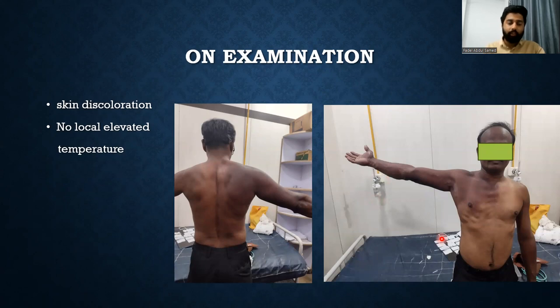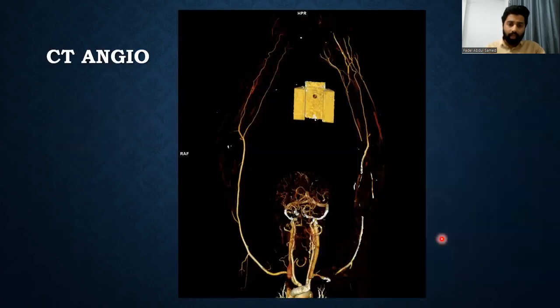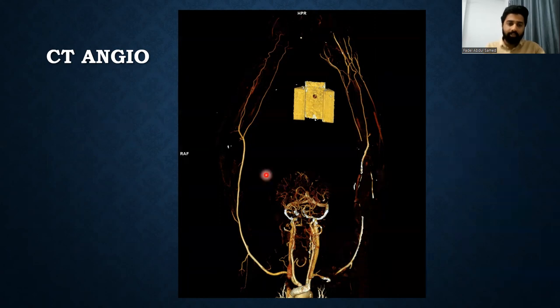As per the clinician's request, we performed a CT angiography. On arterial phase, we observed that the bilateral upper limb arterial system were normal. This is a 3D reconstruction image depicting the same.